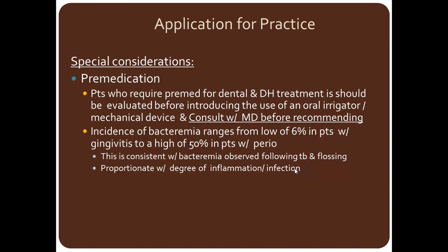Something you want to consider with oral irrigation is pre-medication patients. Those who require pre-med for dental hygiene care should be evaluated before recommending the use of an oral irrigator. They really should consult with their physician before you recommend it. Okay, the incidence of bacteremia ranges from 6% in patients with gingivitis to a high of 50% in patients with perio.